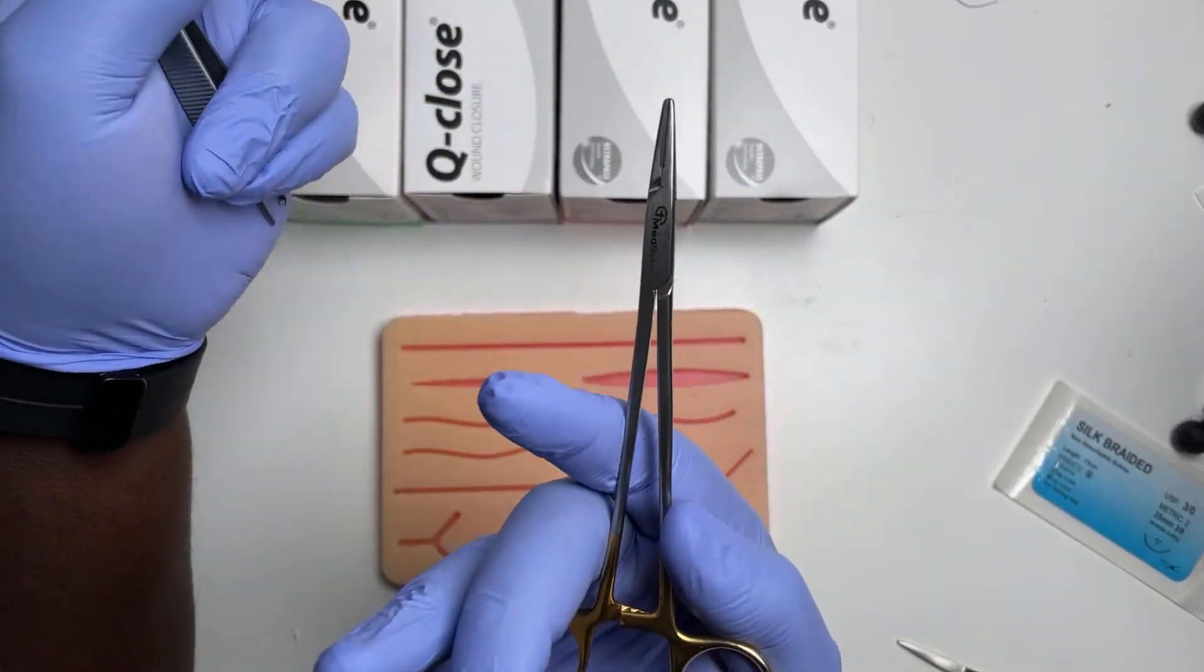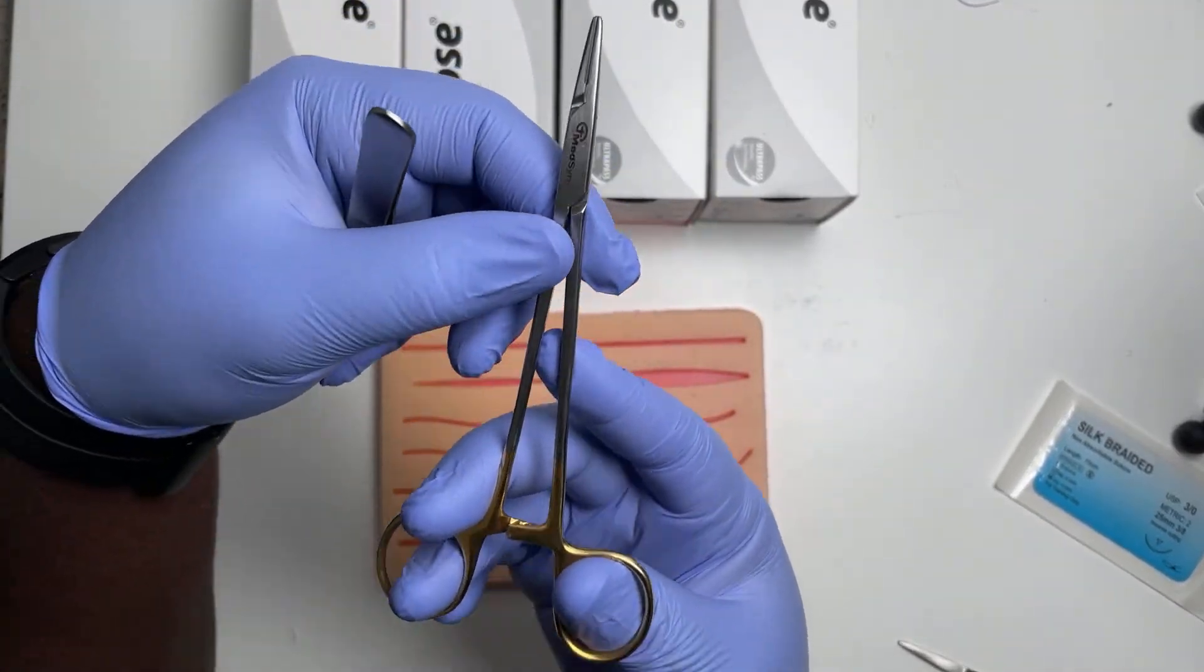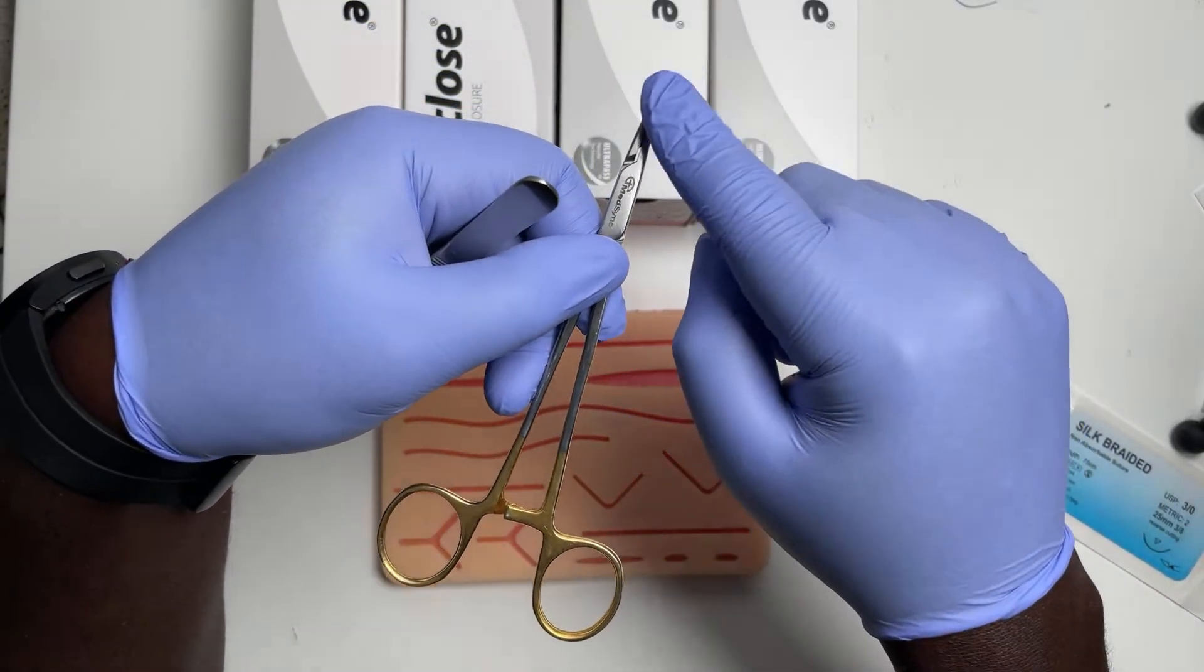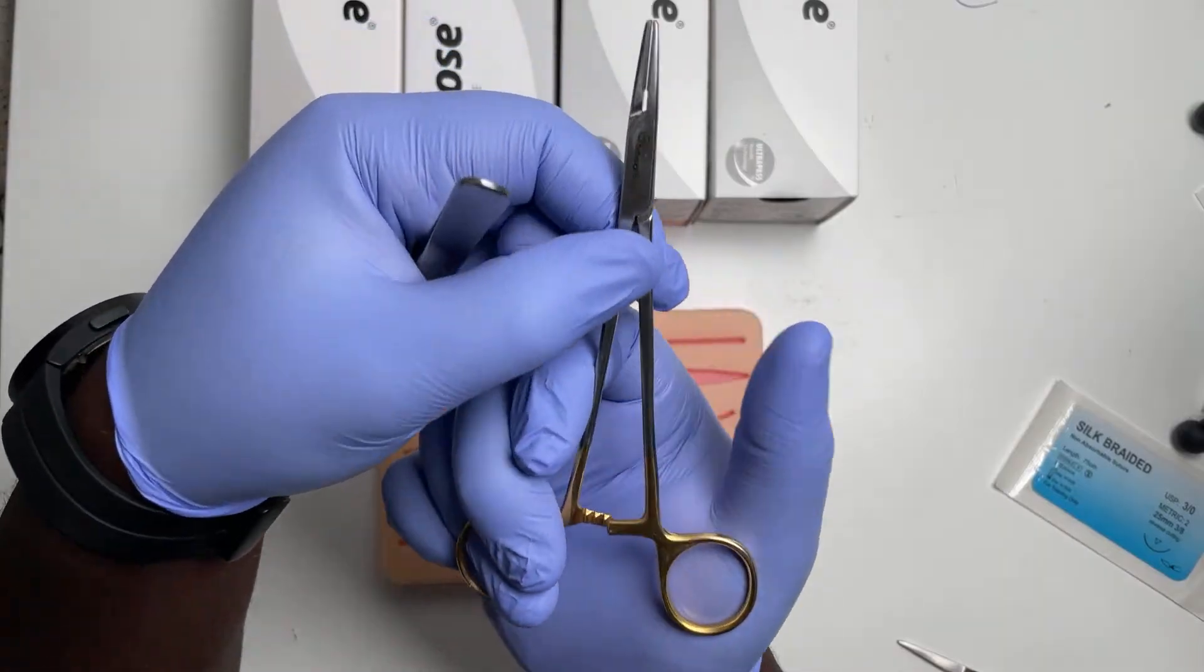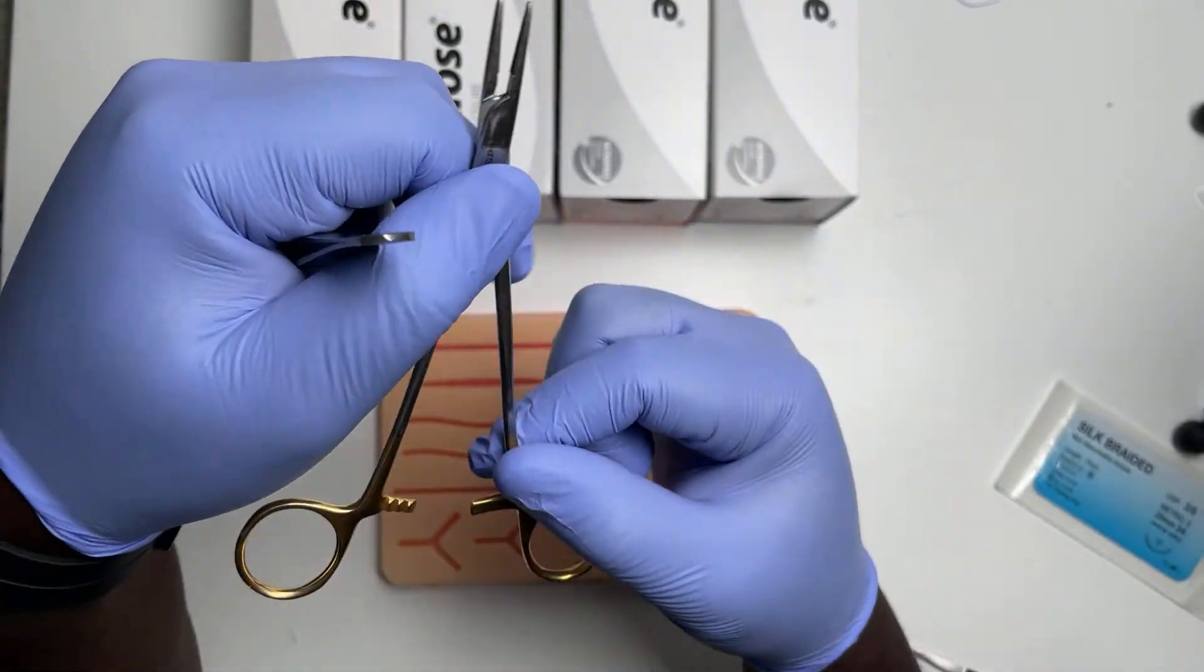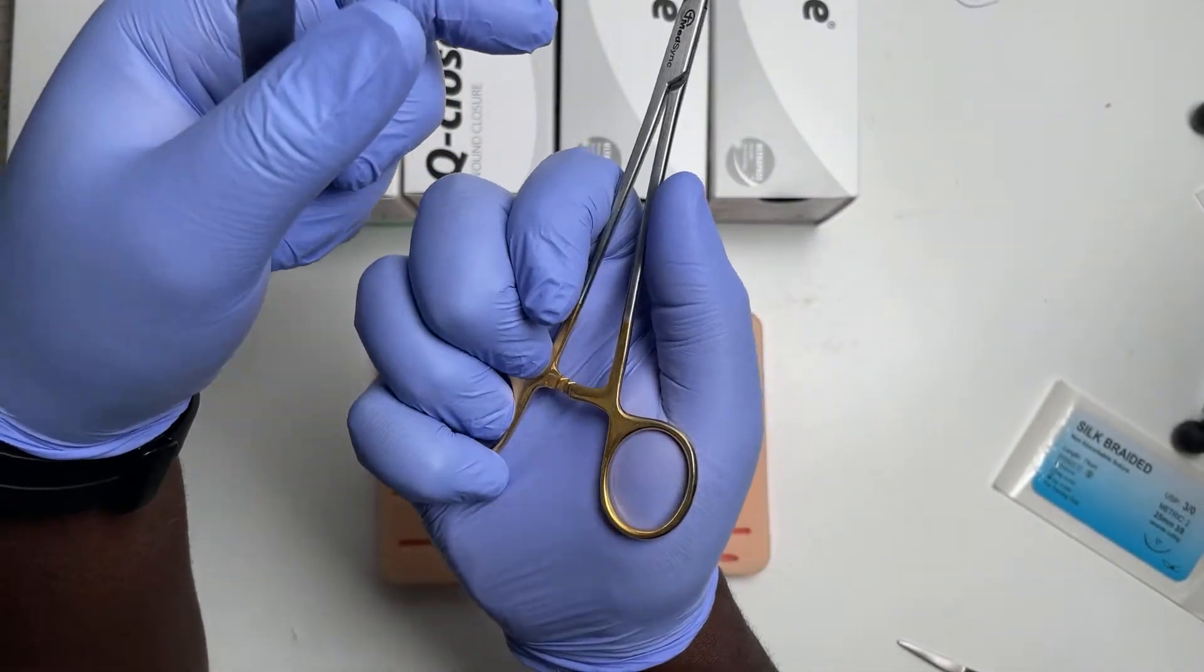It works really well when you're using a bigger needle holder. This is just for skin, so it's a small tungsten carbide needle holder. Tungsten carbide, the gold means it's got better grip. And you can see that because it's got the cross hatching at the teeth.